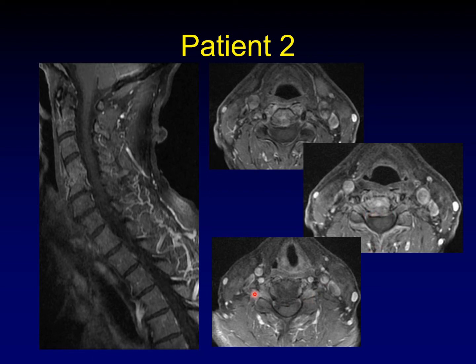We can see abnormal enhancement within the neural foramina. This extensive enhancement is the result of infection. This is a discitis osteomyelitis with collapse of the disc and abnormal enhancement that is infection in the surrounding soft tissues.